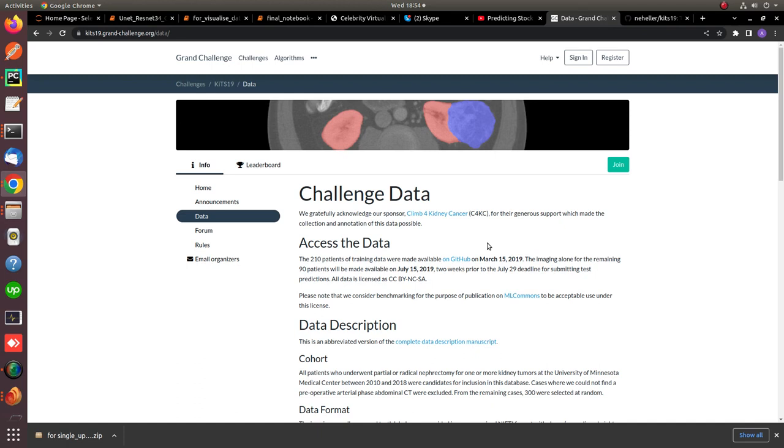So, one of the major improvements seen so far in terms of medical datasets is that the diagnosis of tumors can be done much more efficiently than by a human. So, with the aim of this improvement, recently in 2019, the KiTS dataset was also made publicly available. When I encountered this dataset, I thought I should create a video about it.